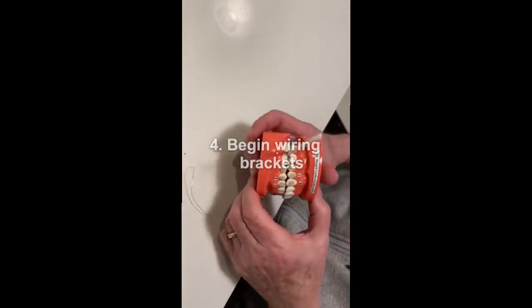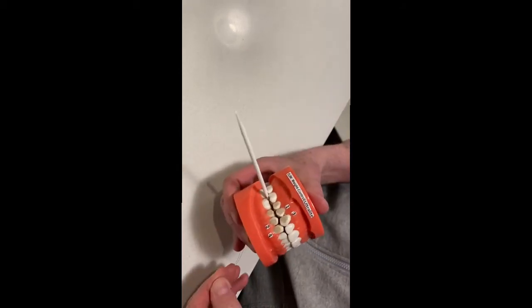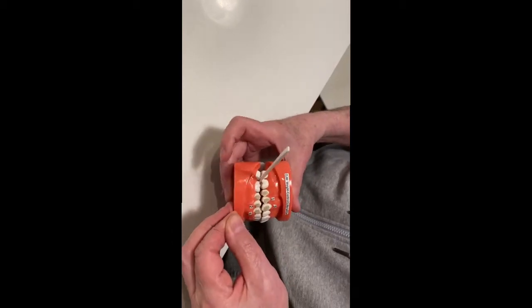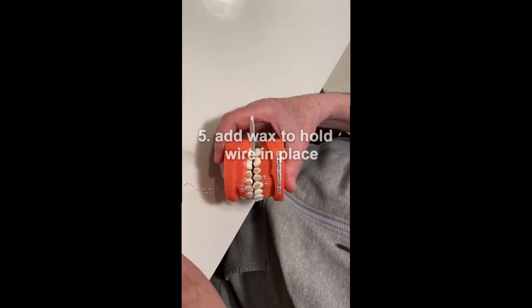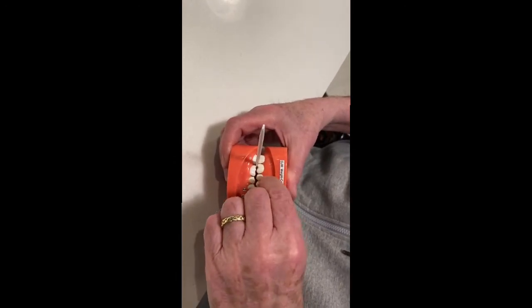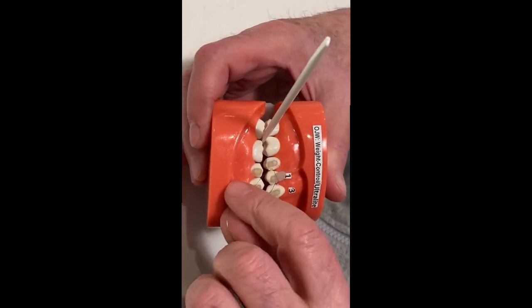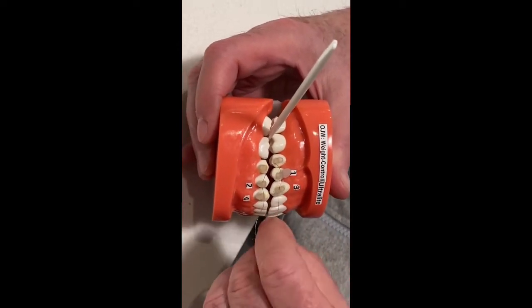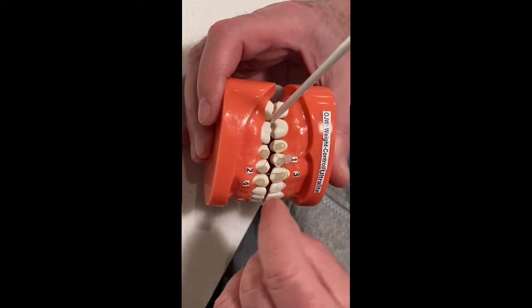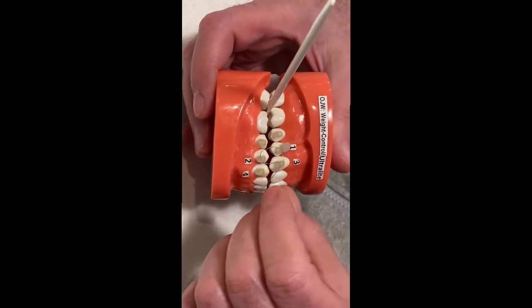Then take your piece of wire, put it on bracket number one, place it into the slot of bracket number one, tack it in with a little piece of wax, then take the bottom part of the wire, put it under bracket number 2, then put it into the slot of number 3. Then take the top part of the wire and just simply bring it around and join under 4.